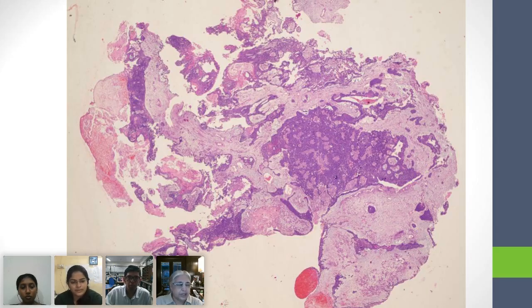Now, that is, yes, okay. Kshitija, I just want you to close your eyes. Close your eyes and imagine that there is an oroantral fistula, and think, how do you think that this piece of tissue came through the oroantral fistula? What do you imagine is the clinical appearance of this tissue which came through this fistula? Can you articulate that?